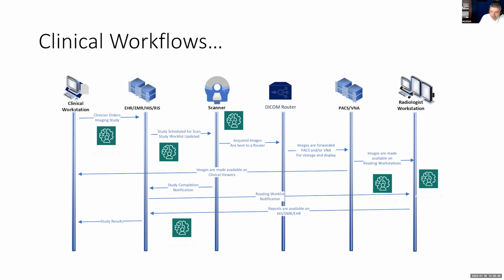Along the way, even though radiologists would receive this image on their workstation, they wouldn't know which one to read in which order. At the same time, the EMR would populate what we call a work list. And on that work list, radiologists would know which images to look for on their daily workflow.